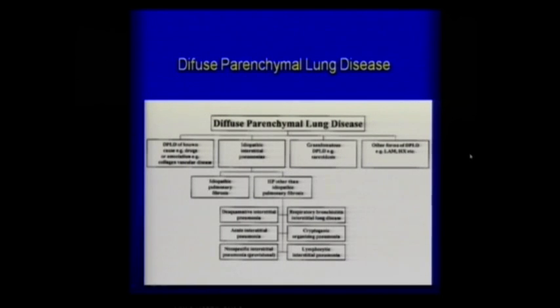You do not even need a surgical lung biopsy, but the other 6 might need biopsy or might not need, depending upon how specific the appearances are. So idiopathic pulmonary fibrosis stands out as a separate entity, but the other 6 are there.